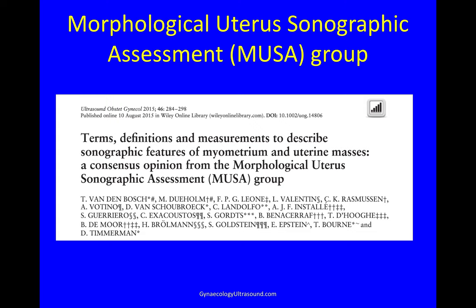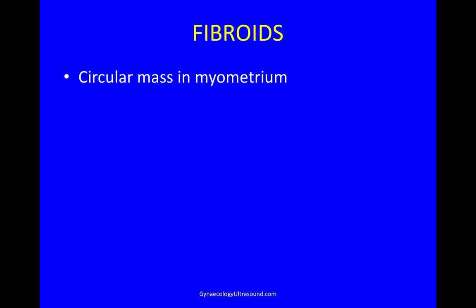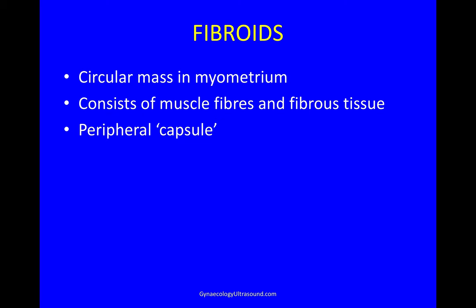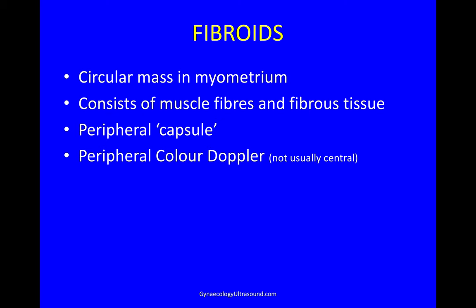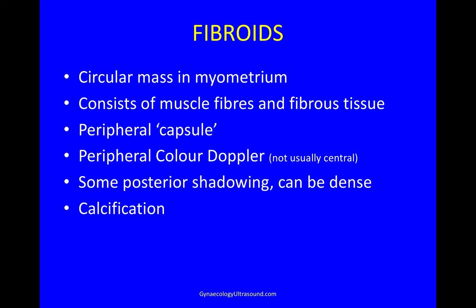Fibroids are a circular mass in the myometrium consisting of muscle fibers and fibrous tissue with a peripheral capsule. You'll find some peripheral colour Doppler flow, not usually central though it's not impossible, and some posterior shadowing which can be dense. There's often calcification in fibroids and where there's one there's often others, so do look around for other fibroids.